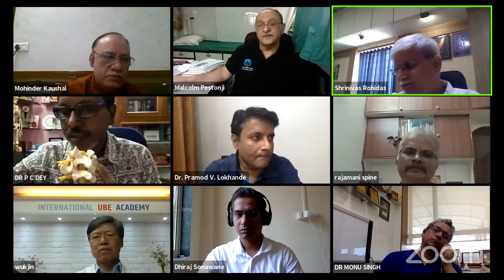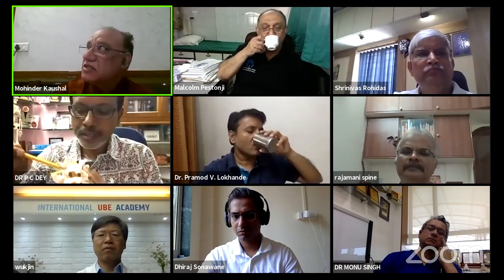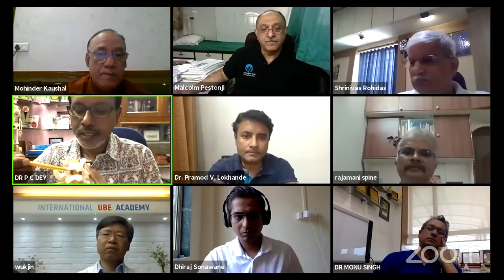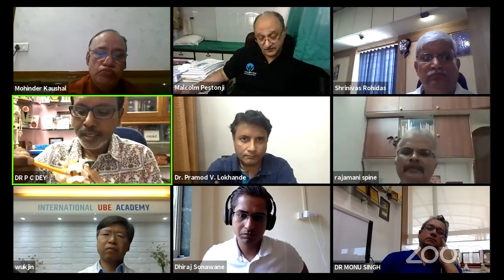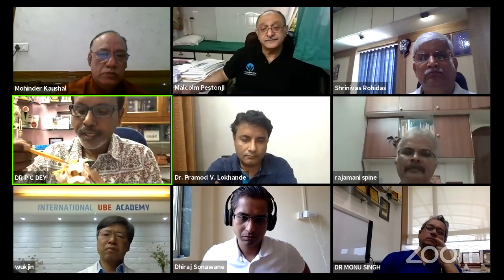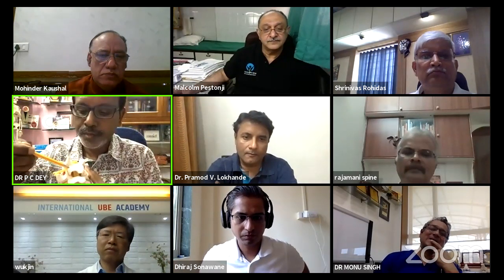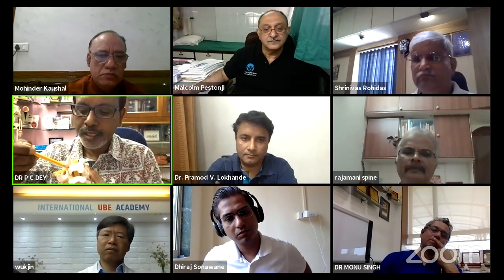Can I interrupt? Yes, please, highlight on the model, educate us more. So, Pramod, you are here in the interlaminar area, and in the interlaminar area you are doing everything. But if it is extraforaminal, you just lodge the instrument here, just 5 to 10 millimeters, or say 7, 8 millimeters above, and maybe 5 millimeters lateral.